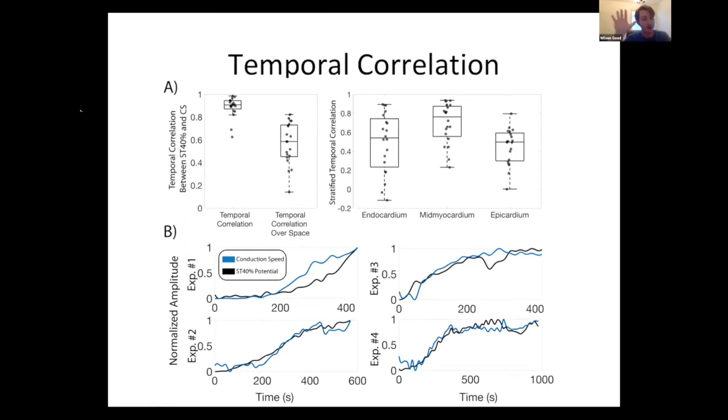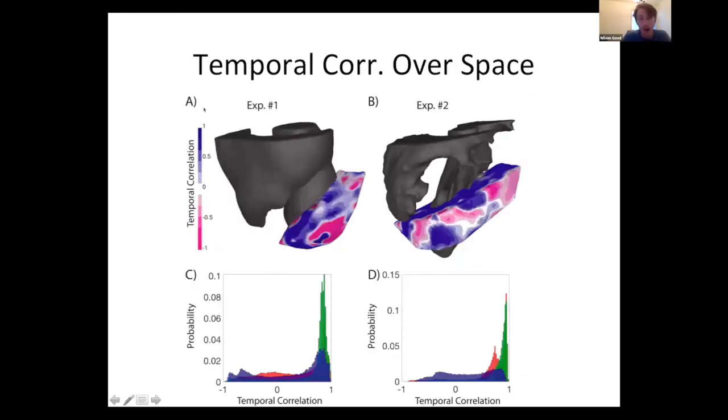A volumetric thing, you can think of, I think I've used the example of submarine bubbles crashing against the ocean surface, right? I mean, you can get an idea of what's going on, but it's not a perfect depiction. And then take the idea of things hitting it at a slanted angle, not just an upward angle, and all these other things you can imagine could complicate this story quite a bit. Oh, yeah, I didn't realize I had this picture. So now we're looking at the temporal correlation over space. And so we have this volume of tissue here, that needle envelope that I've mentioned.